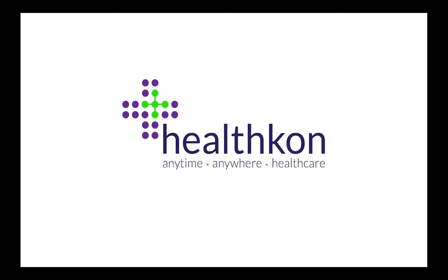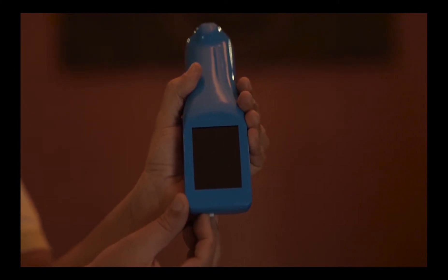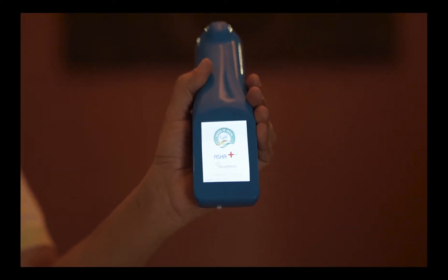Namaskar. Welcome to the HealthCon ASHA Plus training video. ASHA Plus, or Affordable Smart Health Accessory, is a handheld multivitals monitoring device.